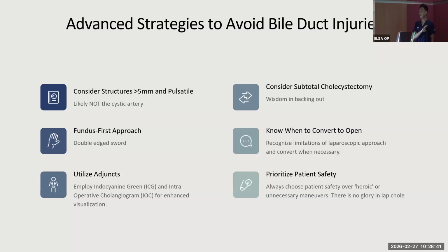It's reliable, and even for transplants nowadays, sometimes you don't even do IOC to confirm that. So you can just use the ICG itself and translate the amount of this. So if you give the right dose, it is a good guide. And if I can't perform IOC, then this is a good way to see the signal.